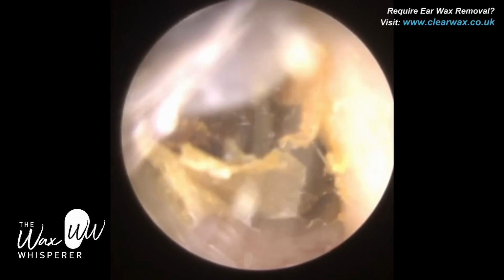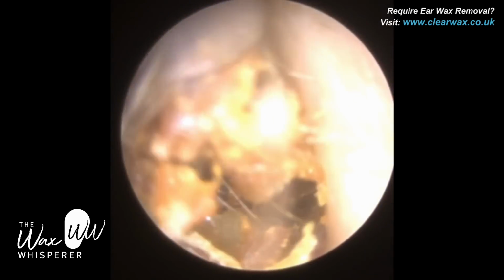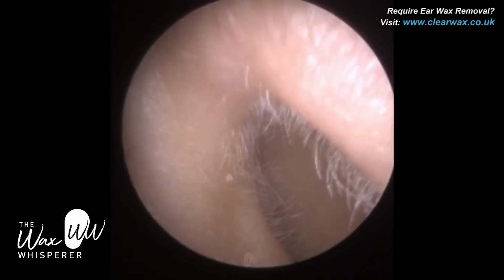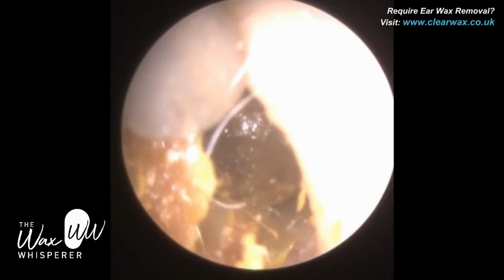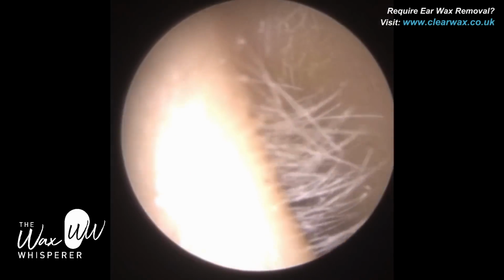You can see that keratin actually coating the plug of wax, and it's also at the bottom, slightly adhered to the base of the ear canal wall. So it's coming out more in pellets, this type of wax. It's little dry pieces. So the patient still has a bit more. This is actually dead skin, and we're just loosening that from the anterior canal wall.